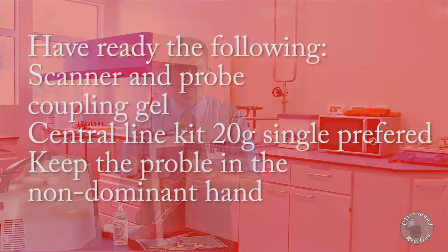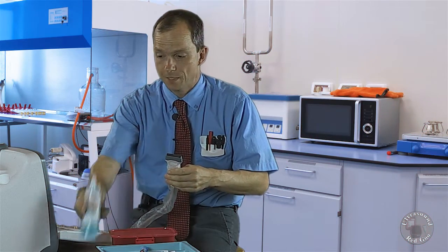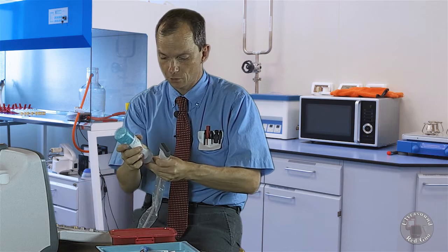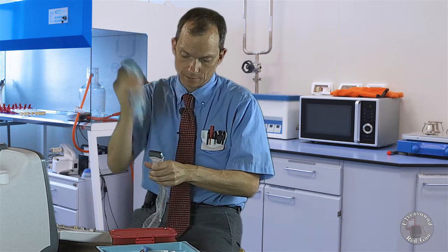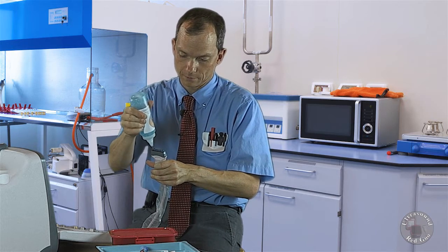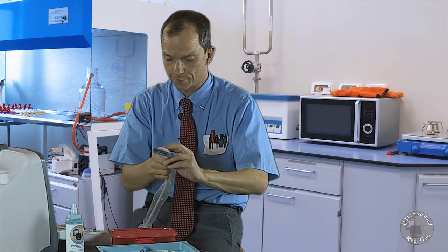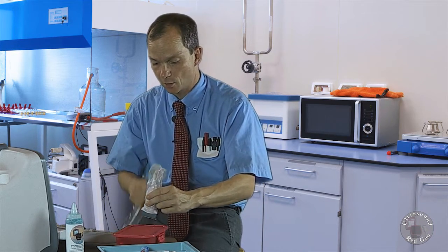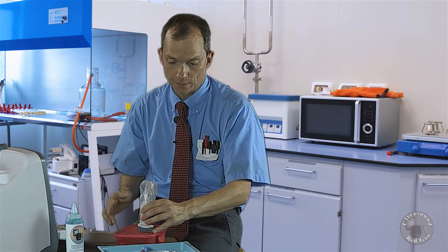Okay, great. So what we're going to do now is put our coupling gel on. Again, I have the probe on my non-dominant hand, which is my left hand because I am right-handed. Just put that coupling gel down just like that. I want to get good conduction so that the sound can go into my subject, whether it's a person or in this case a phantom target.